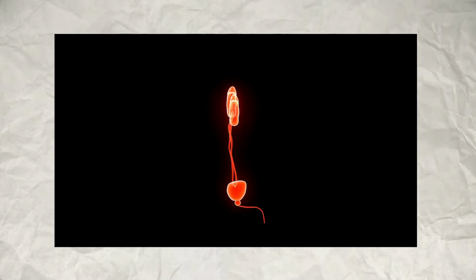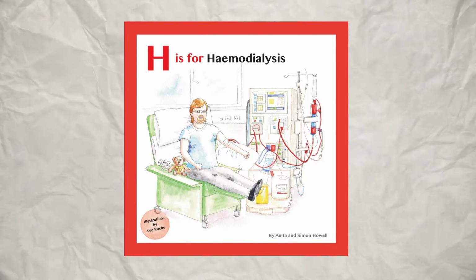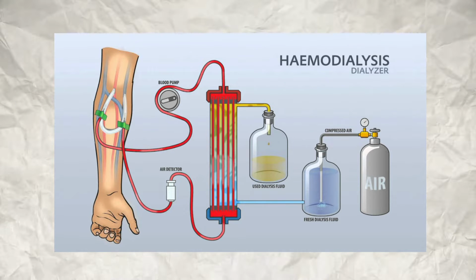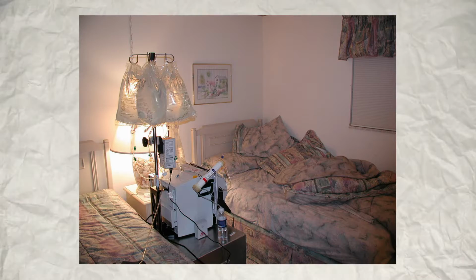To get your blood into the artificial kidney, the doctor needs to make an access or entrance into your blood vessels. This is done by minor surgery to your arm or leg. This is done either at a dialysis facility or at home.